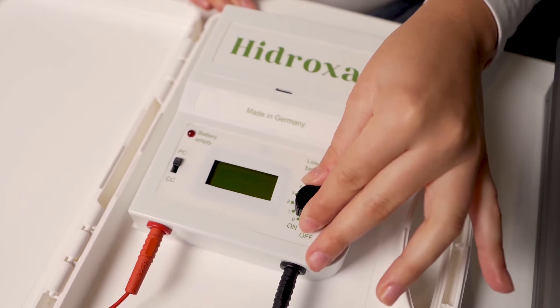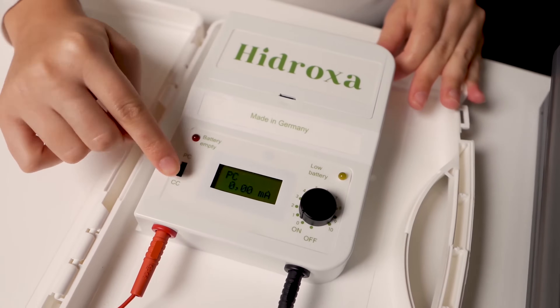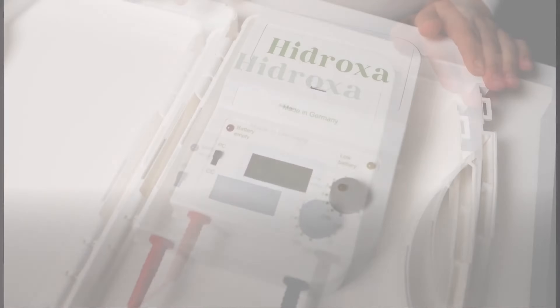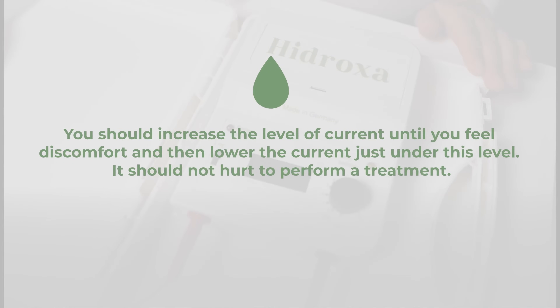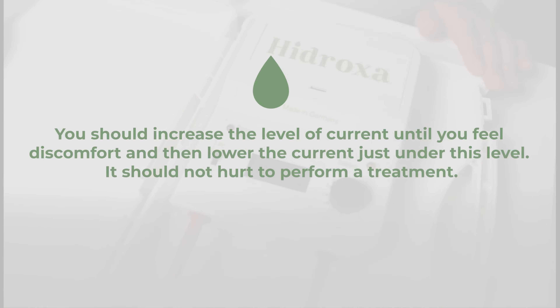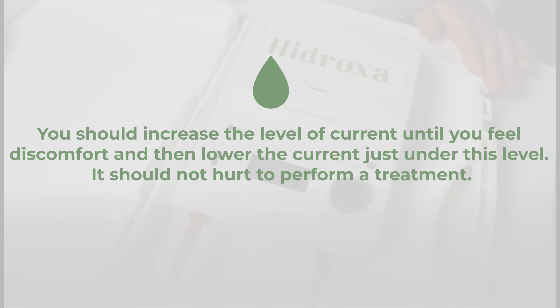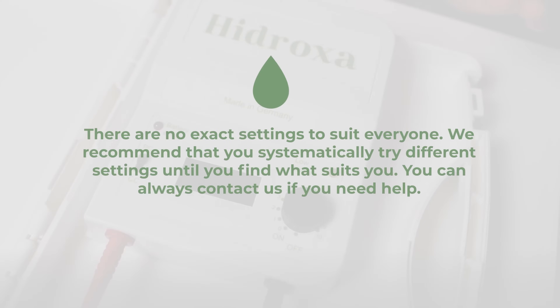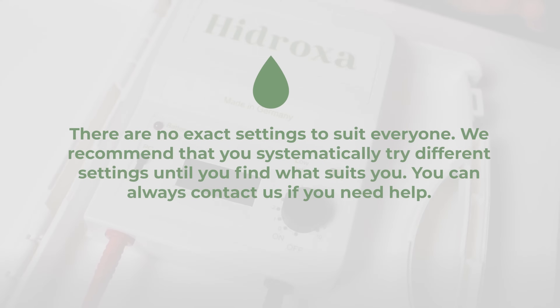When you start treatment, we recommend the use of pulsed current because it is more comfortable, and you will be able to reach higher currents and achieve faster results. Adjust the current. You should increase the level of current until you feel discomfort, and then lower the current just under this level. It should not hurt to perform a treatment. There are no exact settings to suit everyone. We recommend that you systematically try different settings until you find what suits you.